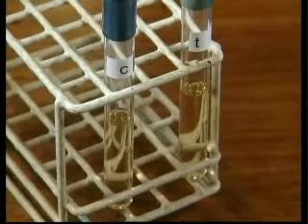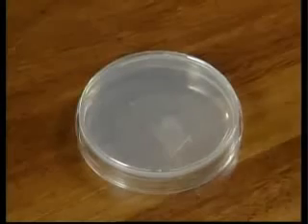If there are too many cells inoculated, there is a risk that some of the sensitive bacteria will appear resistant because of the size of the inoculum. This is the so-called inoculum effect. If there are too few bacteria, the zones of inhibition will not be seen clearly.